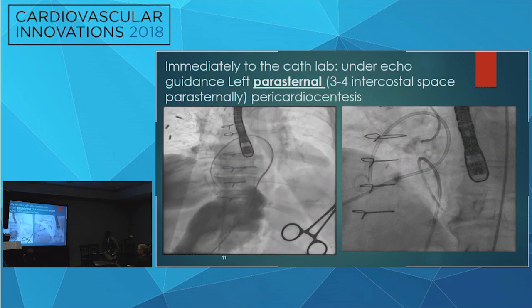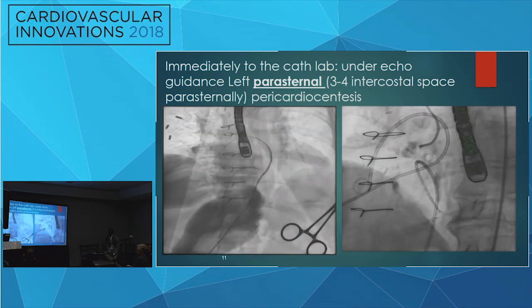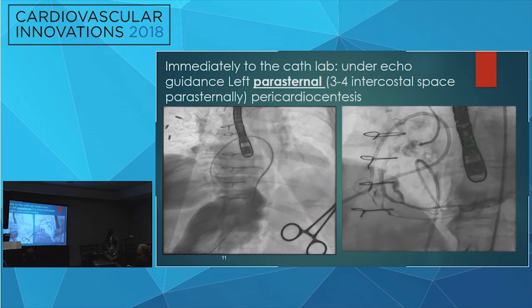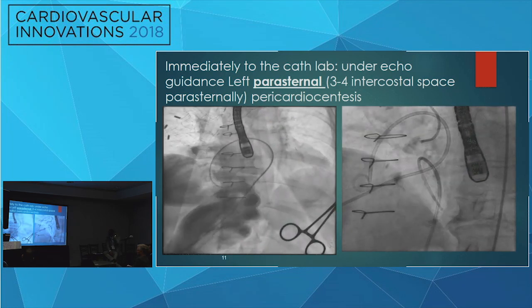It's very tricky. You can't do the regular pericardiocentesis with the apical access because there's no fluid collection at the apex. And it's all left parasternal, and the only window you could see is above the RV anterior, so we had to go for the left parasternal window for epicardial access.